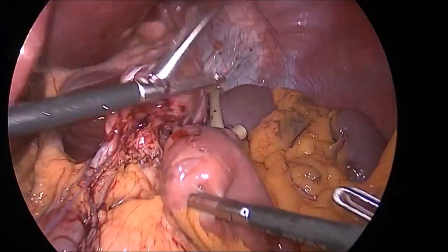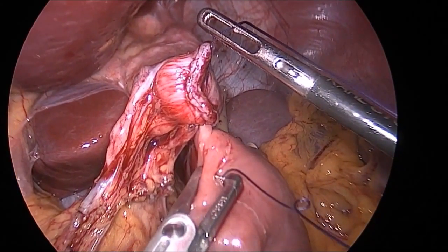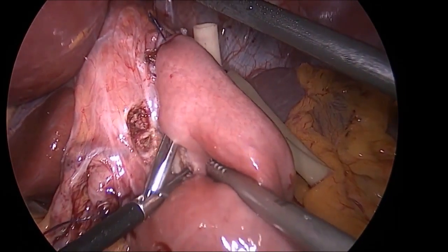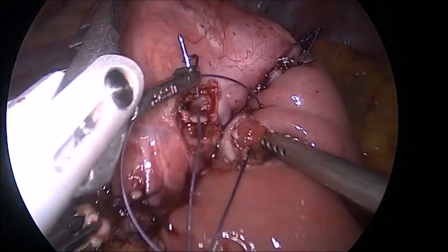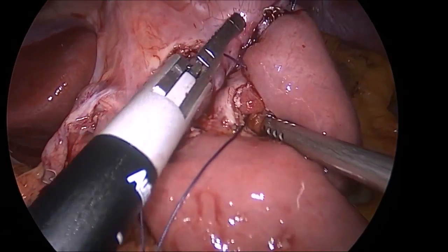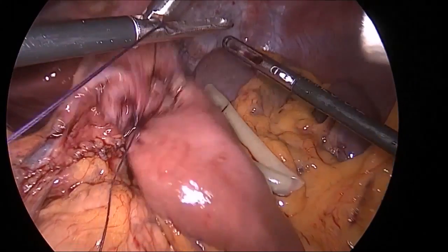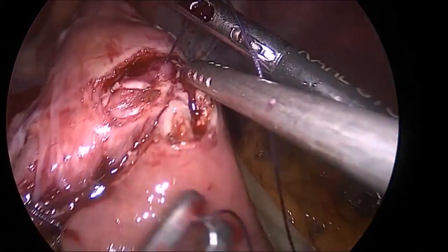We then sutured the Roux limb and the gastric pouch side to side, including the staple line as reinforcement. Using harmonics, we created a gastrotomy and an enterotomy, approximately two centimeters in length each. We then began performing the anastomosis in a hand-sewn manner using absorbable sutures, starting with the posterior wall of the anastomosis from the distal angle and running all the way to the more proximal end. Then in a similar manner, the anterior wall of the anastomosis was sutured using the same suture material.